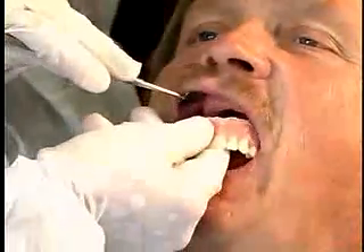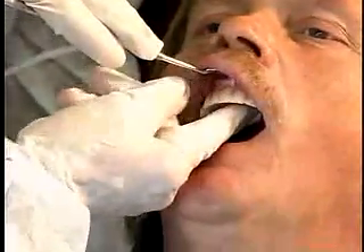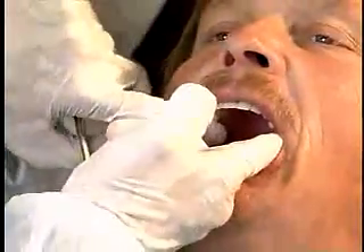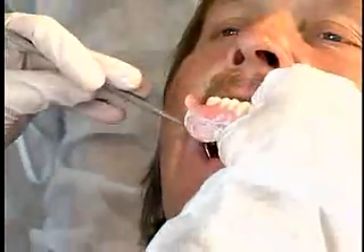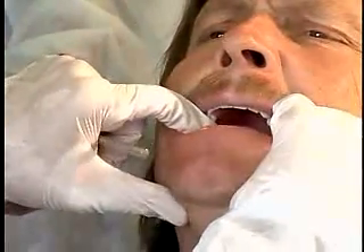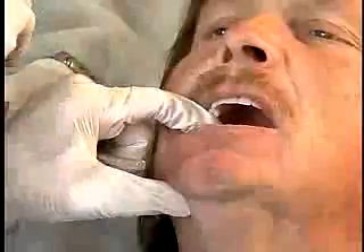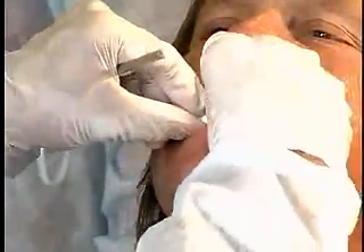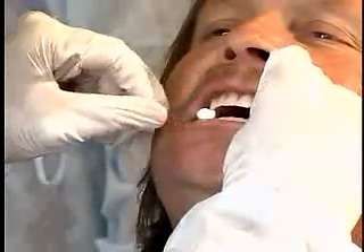Place the dentures in the patient's mouth. Let the patient close on two cotton rolls — one on the right side and one on the left — for two minutes.